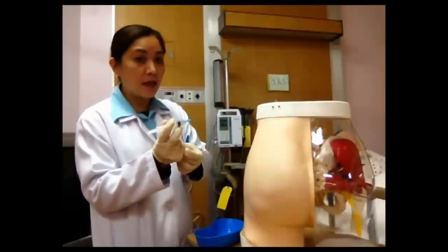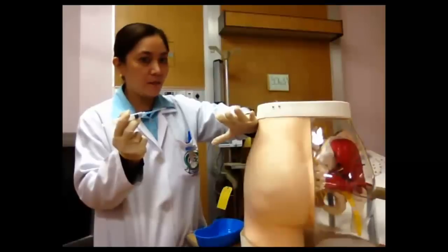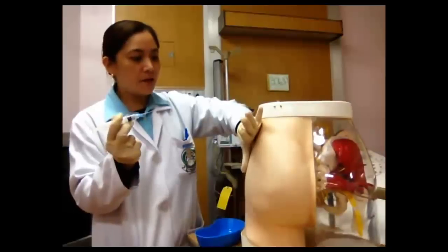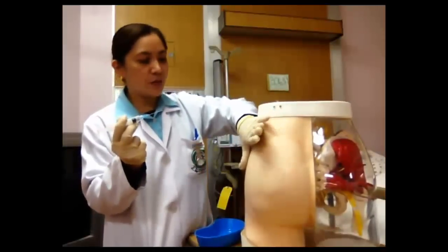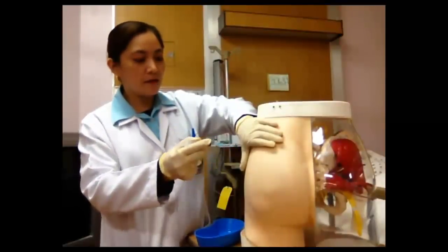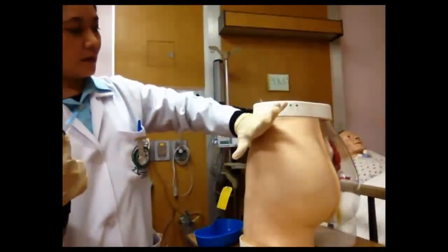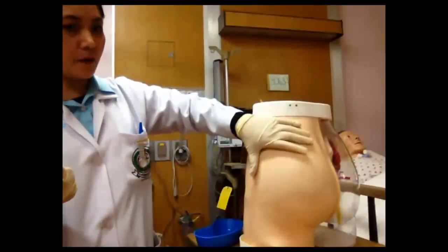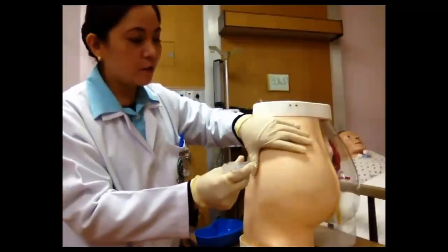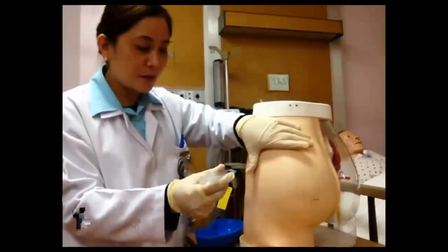How to locate the site of injection? Place your hand on the patient's hip with the thumb at the side of the patient's hip, and the other fingers should be located like this. That triangle area is the site of injection. I will show you. This triangle area is the site of injection. So in a dart quick manner, I will inject the medication into our patient's gluteal muscle.